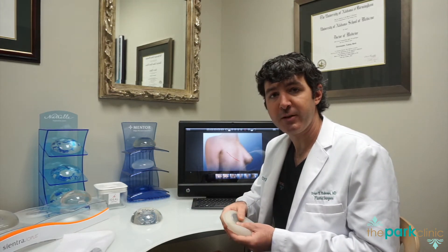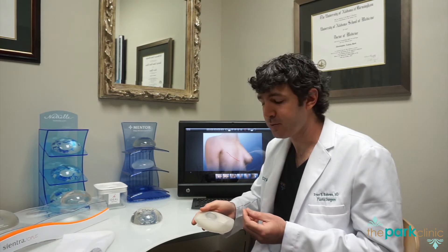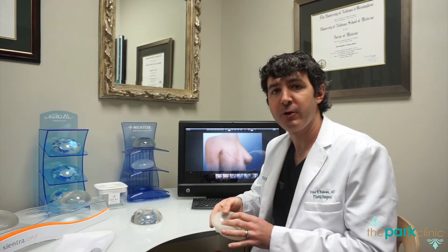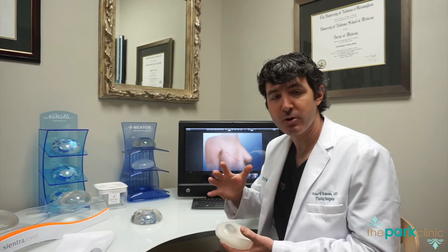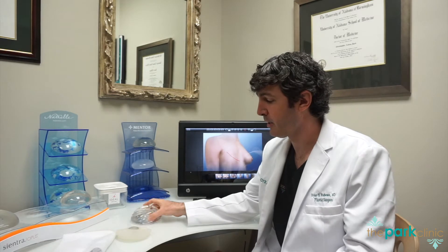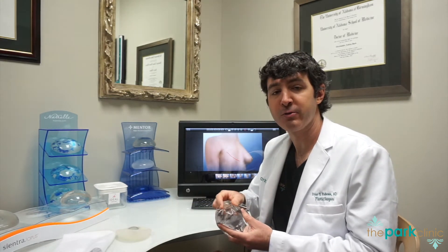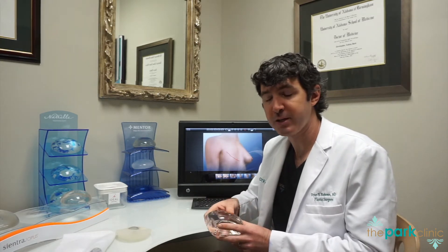We do this by filling the expander both in the operating room and in clinic with a small needle that we place through the skin into this port, and we fill the expander up with normal saline. It will stretch out your skin and become larger over time until we have enough room to place a breast implant, which is softer, more mobile, and more natural-feeling and natural-appearing, giving you the appearance of having a normal, natural breast.